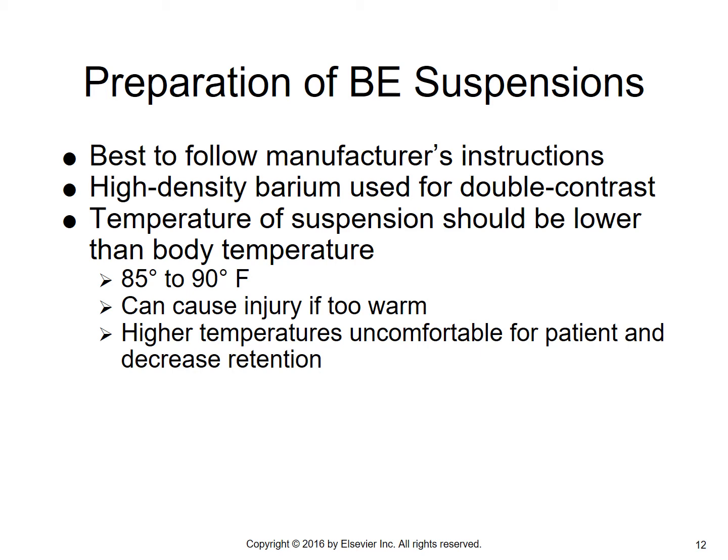One thing that I do want to make mention of too, as far as the balloon, you often see this in registry review books as a question about the enema tip itself. The maximum amount of air that can be inserted into the balloon itself is 90 cc's. So just put that little fact into your mind. The maximum inflation for the balloon is 90 cc's.